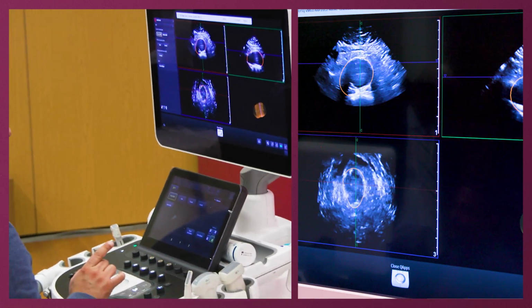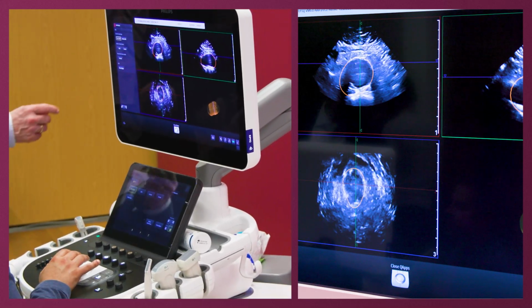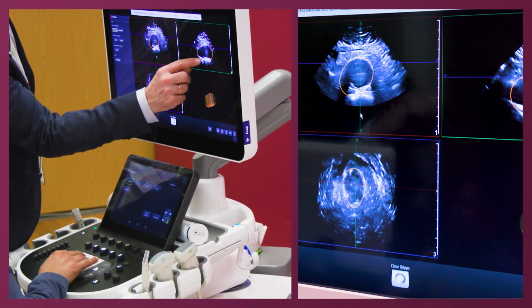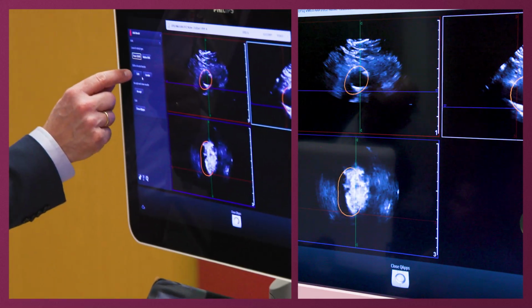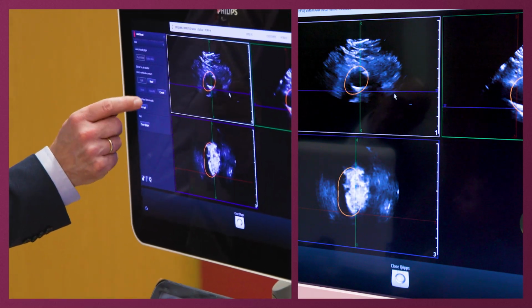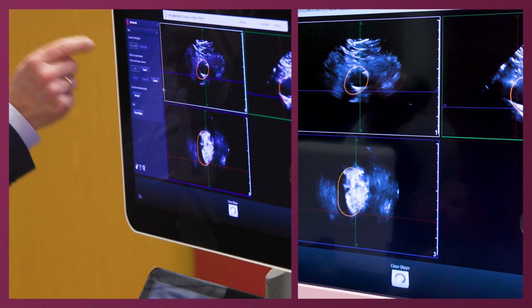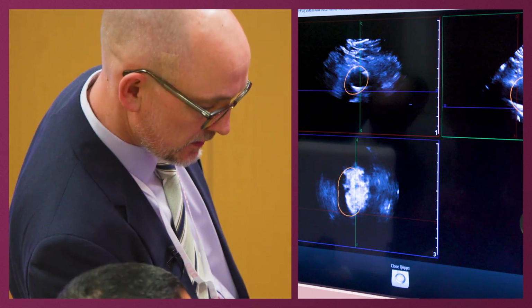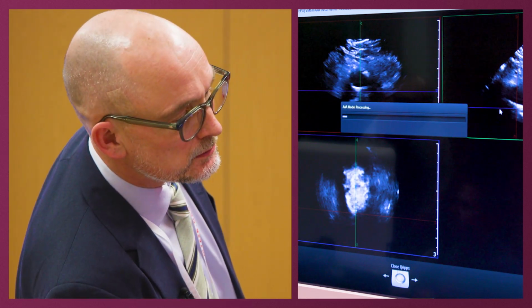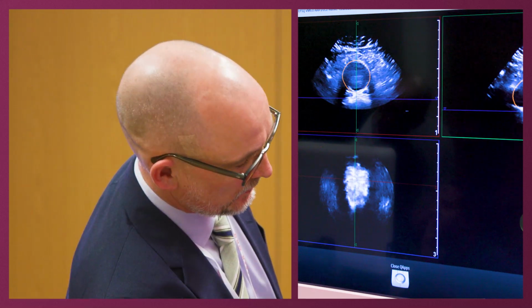So that's a patient with an aneurysm? I think that's one of the Copenhagen patients, and that you can try to. I would be a little bit not satisfied with this, so I think you should push edit. Oh yeah. Okay. So now. Click edit. Actually, we should have, I think go out, and then you should. It's a native. Maybe this would help. Yes. It's a little bit better.